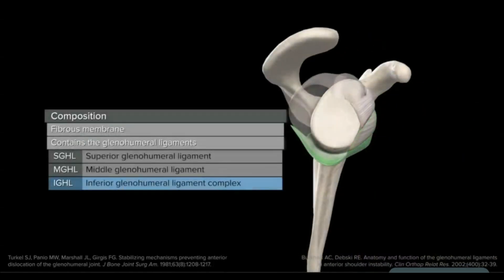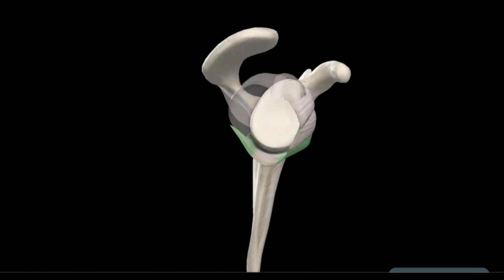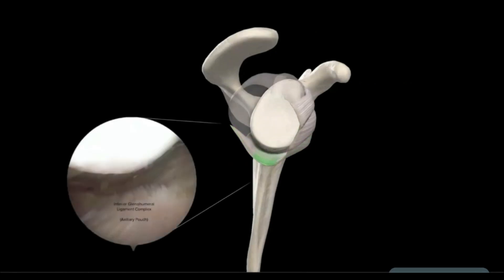The inferior glenohumeral ligament, also referred to as the inferior glenohumeral ligament complex, is the most important restraint of the glenohumeral joint with the arm externally rotated in both the neutral and abducted positions. The IGHL can be likened to a hammock, with the anterior and posterior bands at the front and back acting as ropes that hold up the axillary pouch in between.